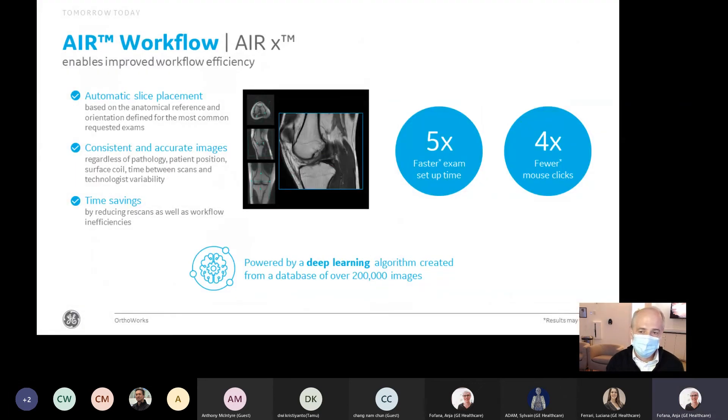When we talk about AIRX, it does automatic slice prescription. It uses deep learning and artificial intelligence, which is entirely different from automatic slice prescriptions in the past, because we've trained a model to identify structures and graphically prescribe across a wide variety of age populations. You can save a significant amount of setup time by a factor of five and reduce the number of mouse clicks by a factor of four — a great tool to streamline productivity and enhance workflow.